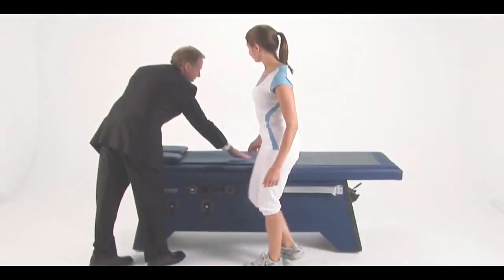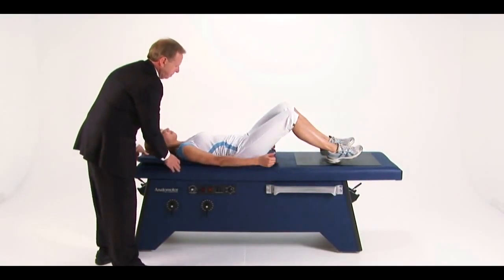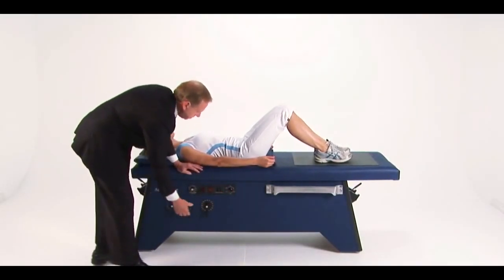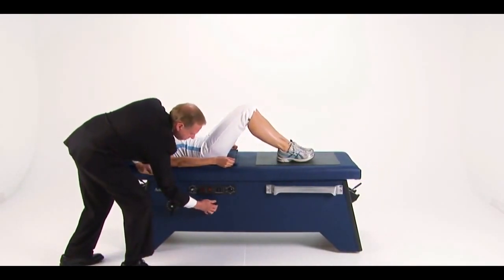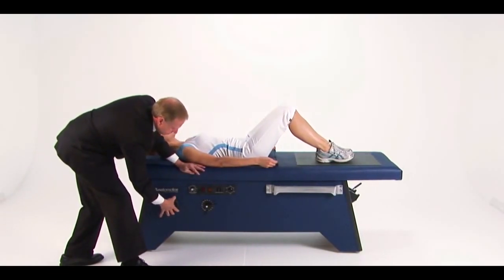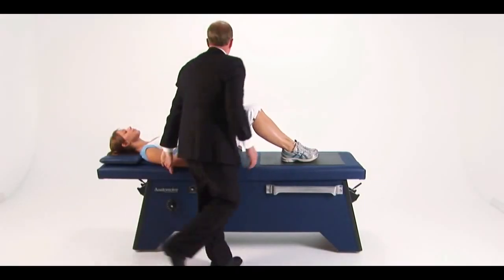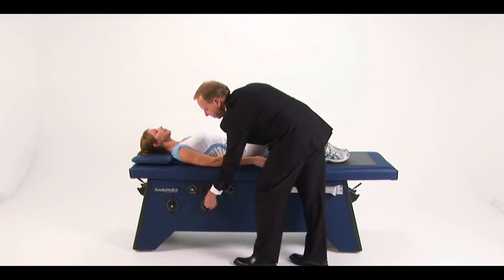When you begin a massage treatment, position your patient so that the full spinal area is in the tabletop opening. Flex the patient's legs to flatten the normal lumbar curvature. In this way, the rollers provide more continuous and equal pressure to the lumbar region. The table will now glide back and forth just under the normal respiration rate, moving the patient over the rollers at about 8 cycles per minute. This rate is most effective in inducing relaxation.